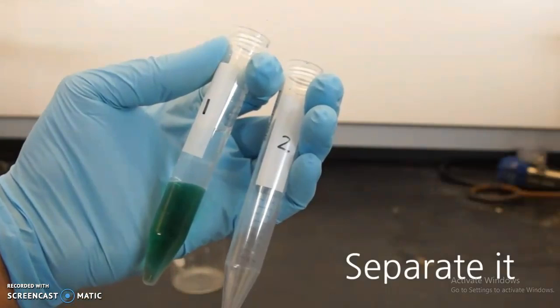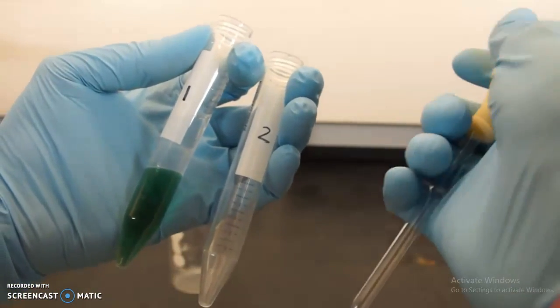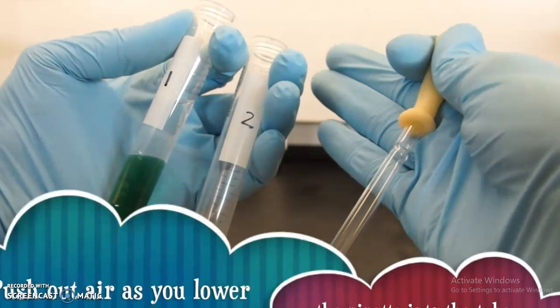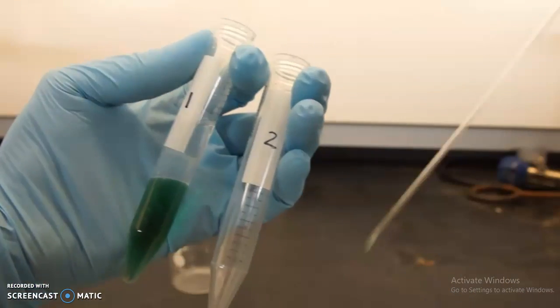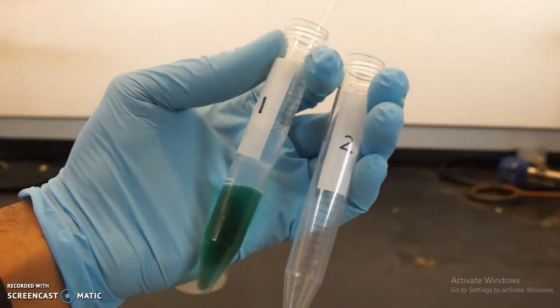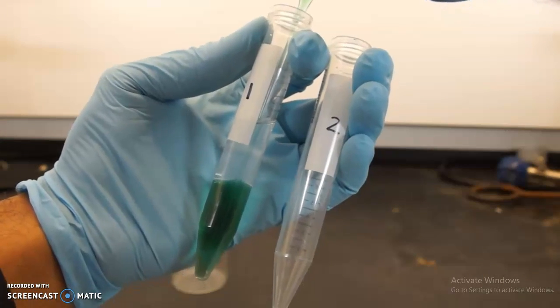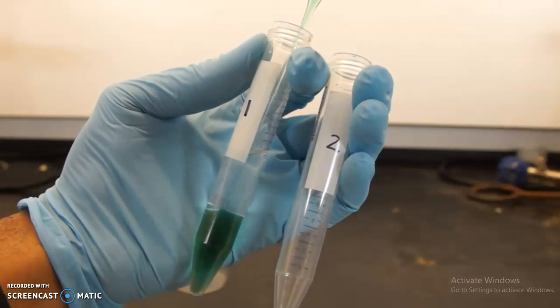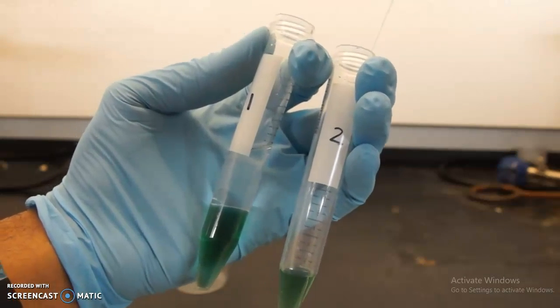To separate layers, grab yourself another Falcon tube and a Pasteur pipette. Make sure that you push air out as you lower the Pasteur pipette into the Falcon tube. Lower the Pasteur pipette all the way to the bottom of the Falcon tube. You only want to draw up the bottom layer, because that's where your analytes are, and transfer it to the new Falcon tube.